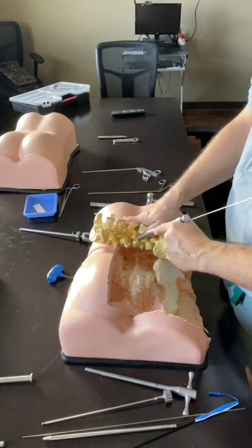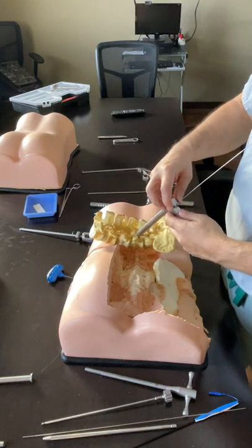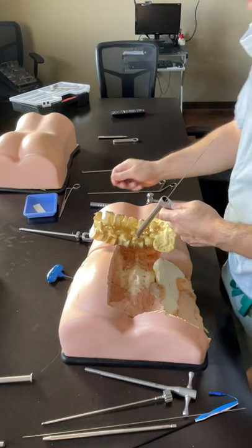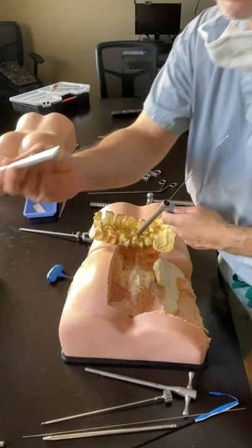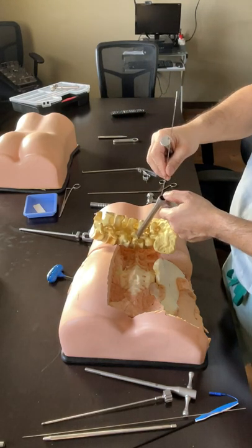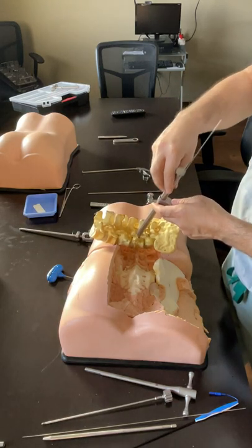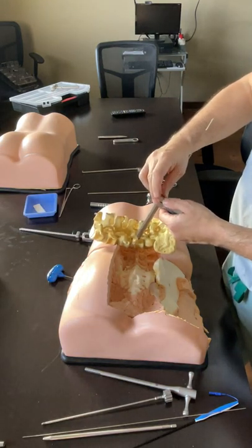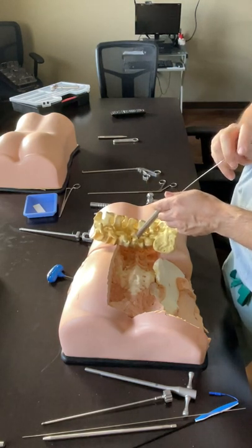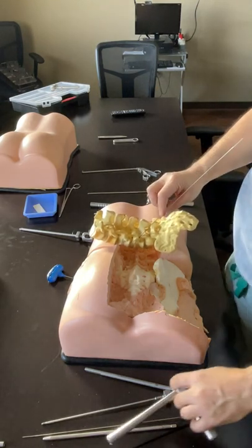Once you have done that, you have opened up the pores of the facet on both sides. Take this out, drop just a little bit of tricalcium phosphate, then use the tamp - the flat piece - same way. Make sure you don't put any tricalcium phosphate behind it, because you need to go in that direction. Put it in, tap it in on both ends, hold it, come out, and at the skin pull it and take it out.